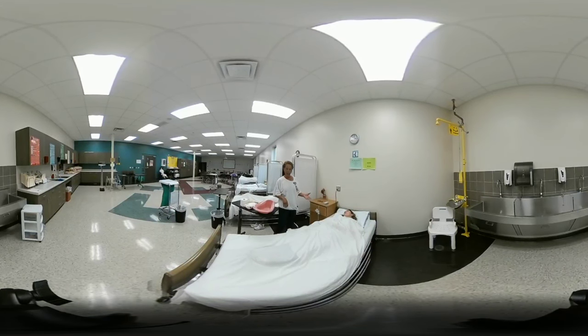This skill is performed on a live person. I have Miss Carla here with me acting as the client. The supplies you will need are: one standard bedpan, a package of hand wipes, one roll of toilet paper, and two pairs of gloves.